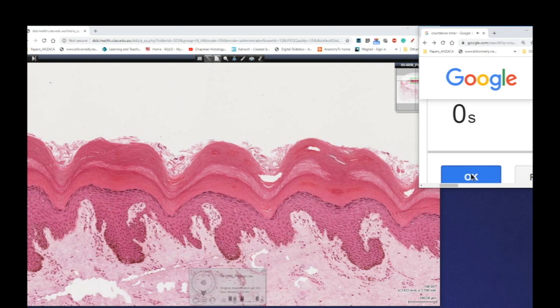As I say, found only in the epidermis in the human body, and very characteristic of that cell death. The cells accumulate that keratin on the surface, which eventually shed from the surface and provide a nice protective layer for our underlying tissues. Hopefully you found that useful.